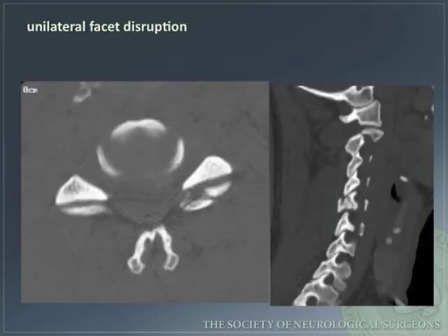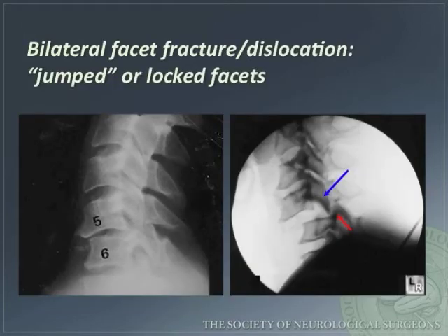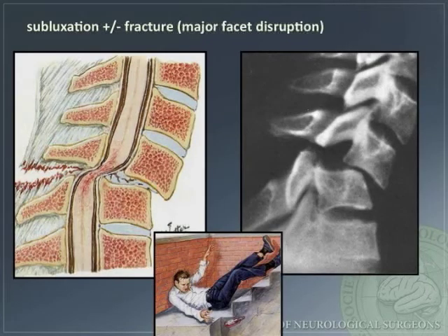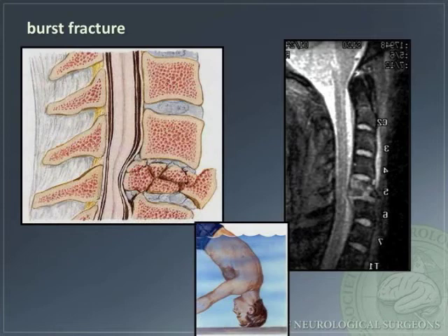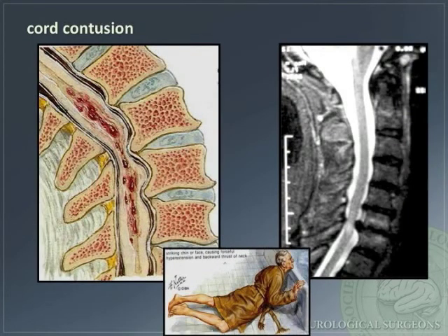Here is an example of unilateral facet disruption. Bilateral facet fracture dislocation may lead to jumped or locked facets, as seen on these images. Cervical spine subluxation, plus or minus fracture, and major facet disruption may occur with trauma — the mechanism is usually flexion. Burst fractures may occur with axial loading. Cord contusion may occur with trauma, typically via an extension mechanism.